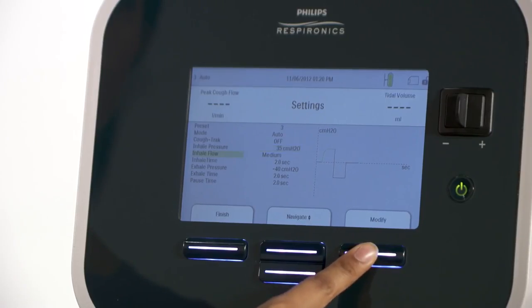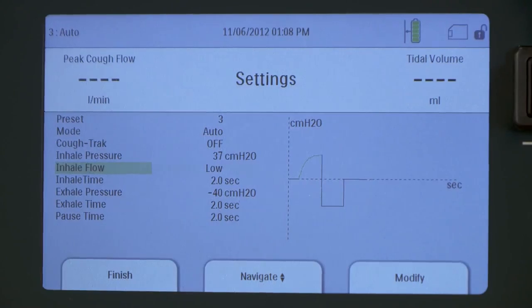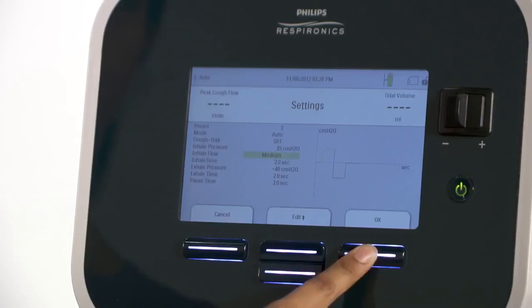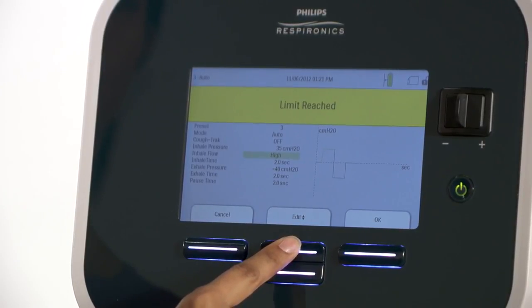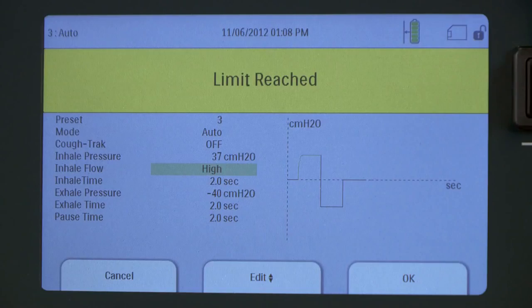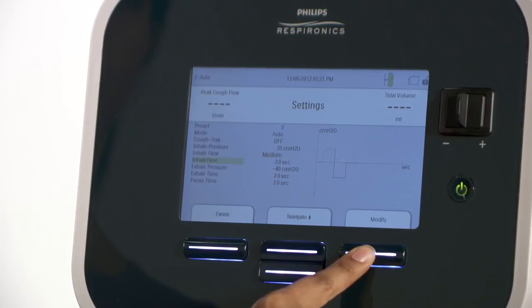Press the right button under OK. Press the right button under modify to change the next item on the list, which is inhale flow. Use the up-down edit button to adjust. If you try to change a setting beyond the available parameters, a limit reached message appears. In this case, after you have entered the correct pressure, press OK to accept the new setting.